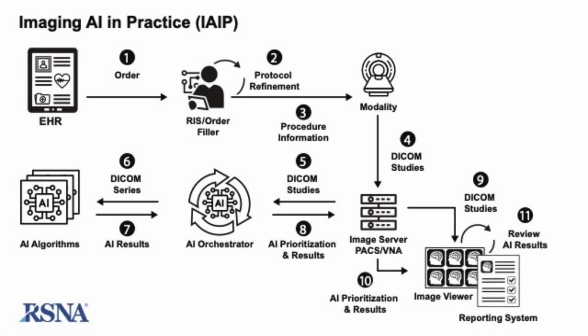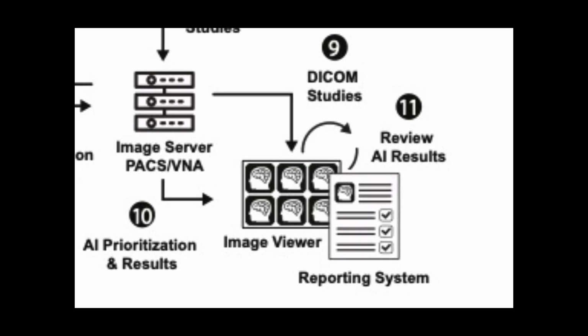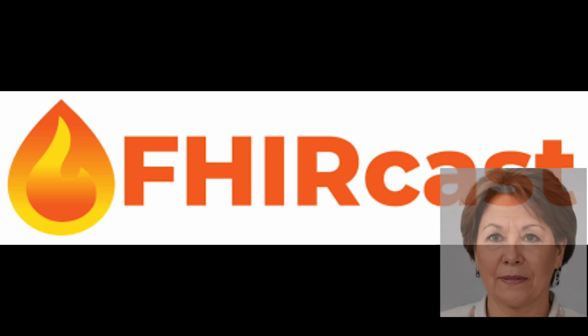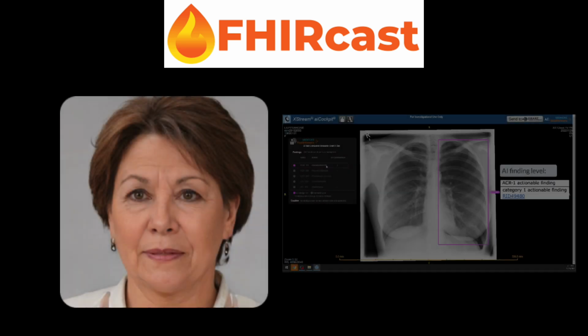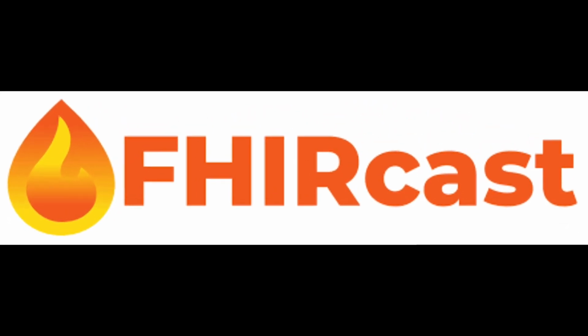You may have noticed that all these different applications, including PACS, image viewers, and reporting, open correctly to the same patient. This is possible using FHIRcast. FHIRcast is not the same thing as FHIR. FHIRcast coordinates applications to look at the same patient securely. FHIRcast, in short, is a standard that synchronizes clinical applications, EHR, PACS, reporting system, and AI tools to a given study or patient. Upcoming versions of FHIRcast will also enable exchange of measurements and AI findings.